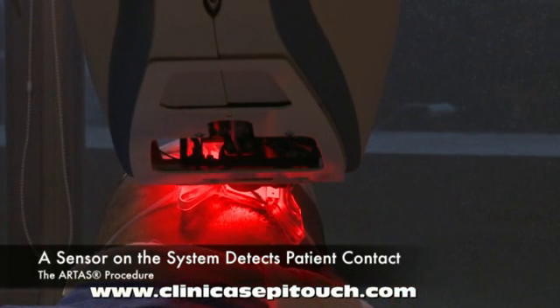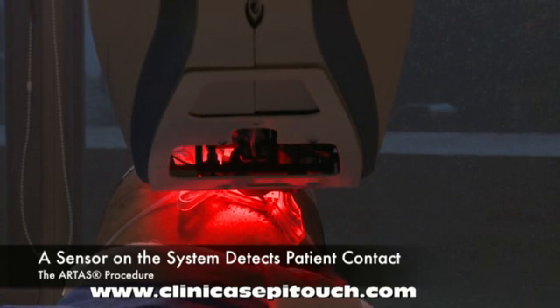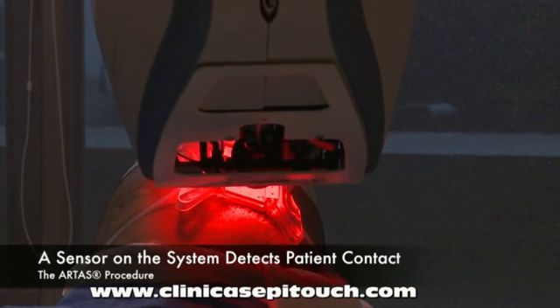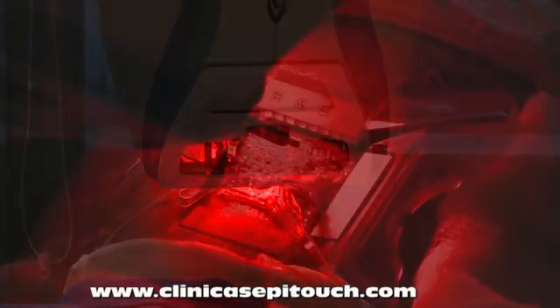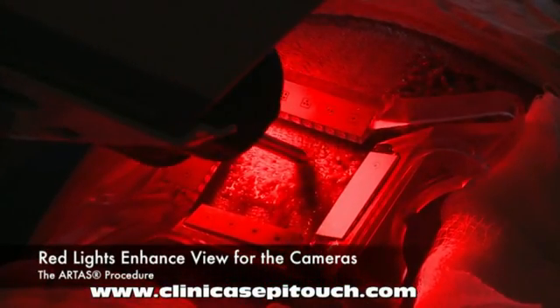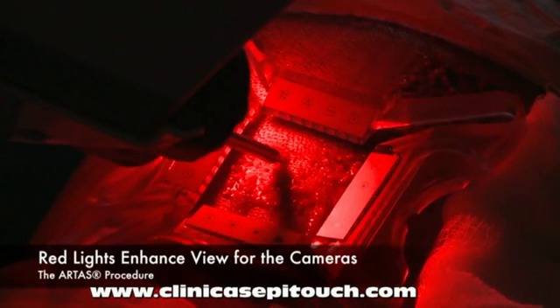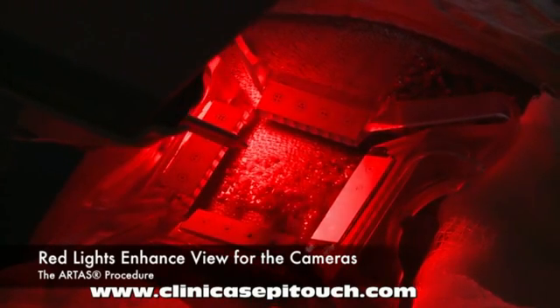Safety is paramount to the ARTAS system. One of these features includes a sensor at the bottom of the needle mechanism. If this sensor detects patient contact, the system automatically retracts the needles and elevates away from the patient. To the human eye, this appears to be a very bright red light; however, to the ARTAS system, these red lights significantly enhance the view for the cameras and image processing systems.